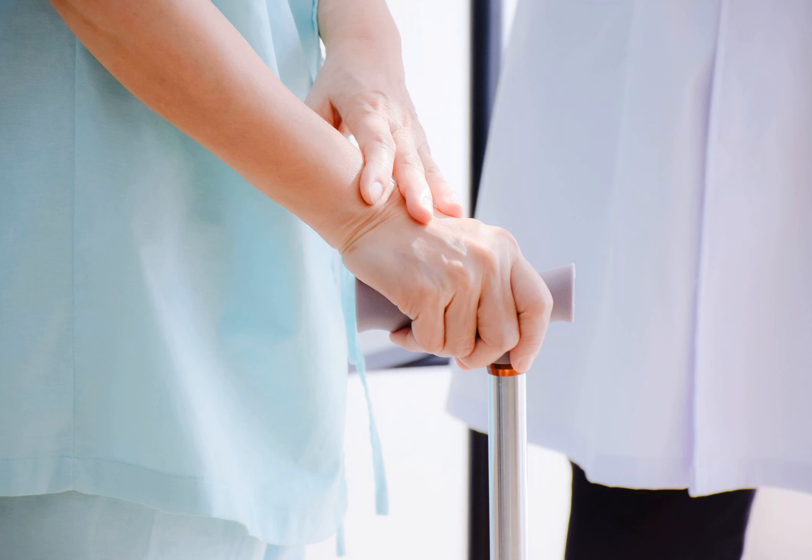If you are having a problem walking or moving about, you may need an assistive device to help you safely get around. Devices such as walkers, crutches, and canes are available to help you walk better and decrease your risk of falling.